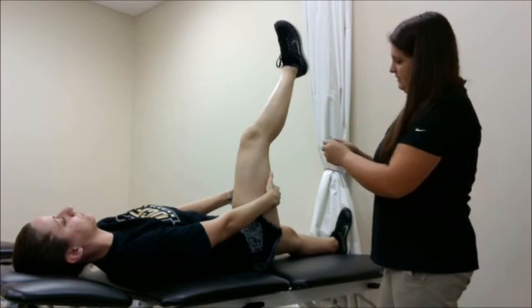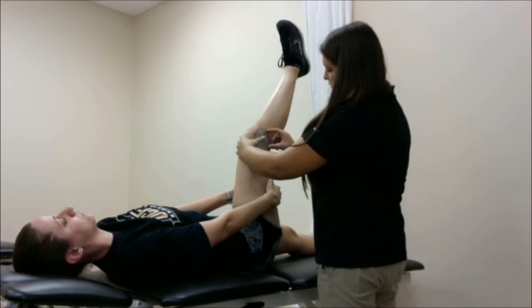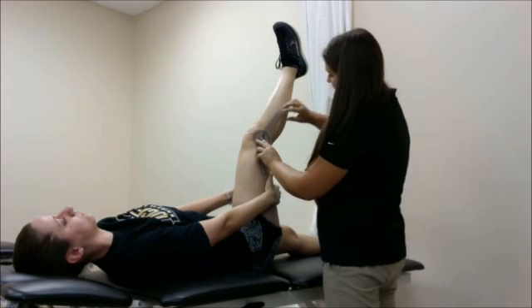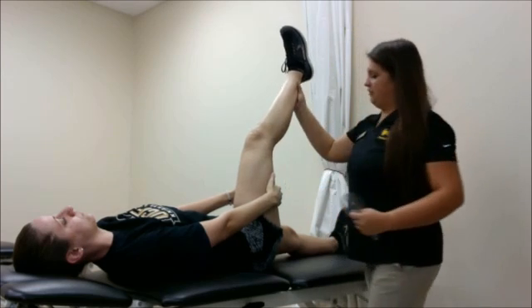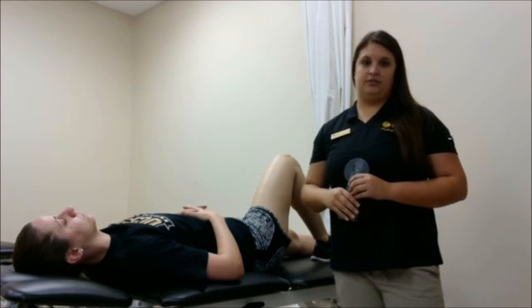Using the goniometer, I'm going to place my axis at the same landmarks as knee extension and flexion — the lateral condyle of the femur, following up to the greater trochanter along the midline of the thigh, and the midline of the shin to the lateral malleolus. Here I'm getting about 29 degrees of knee flexion. Anything greater than 20 degrees of knee flexion is considered tightness of the hamstring musculature.